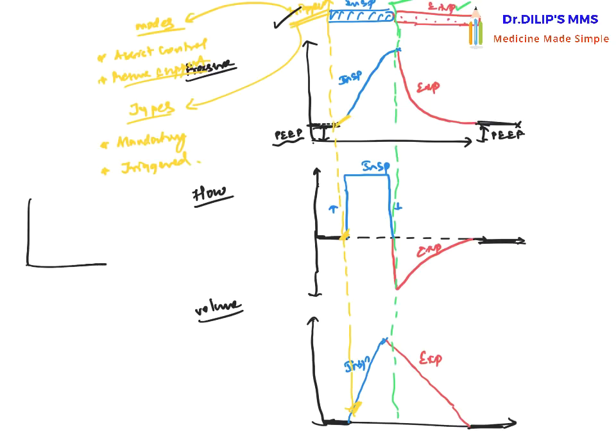Let me draw two ventilator curves that tell you whether it's a triggered breath or a mandatory breath. For example, what is a triggered breath?